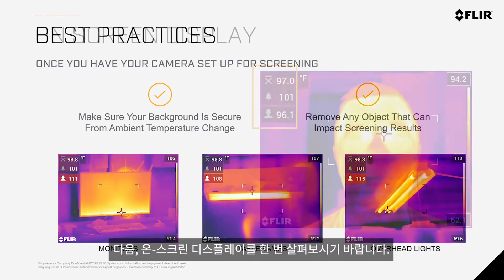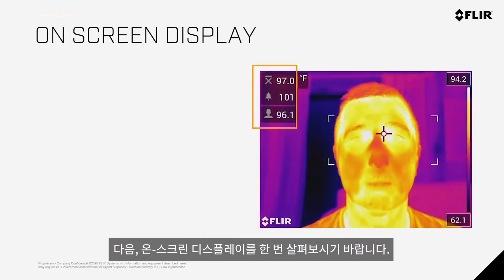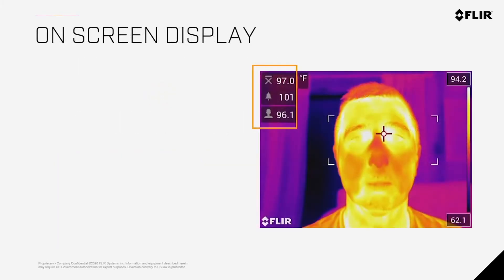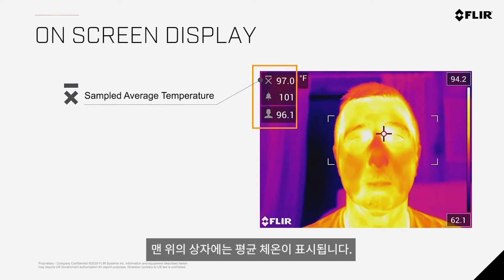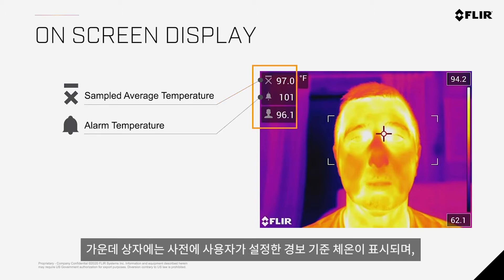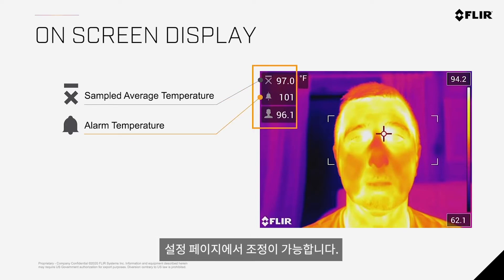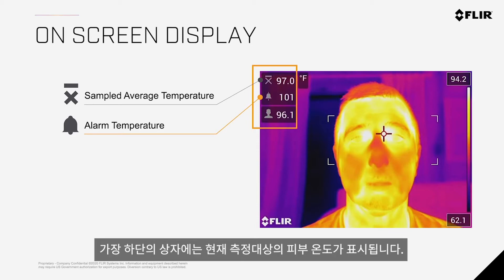Let's turn our attention over to the on-screen display. On the screen, you will see three temperature boxes displayed in the upper left-hand corner. The topmost box displays the average temperature. The middle box displays the set alert temperature, which can be adjusted in the screening mode setup page. And the bottom displays the current subject's skin temperature.